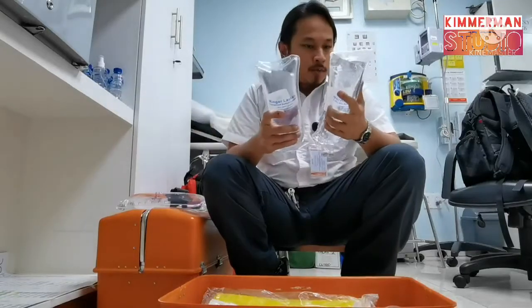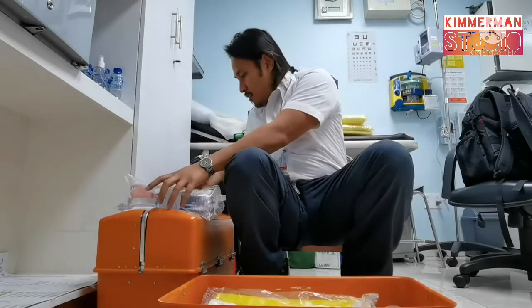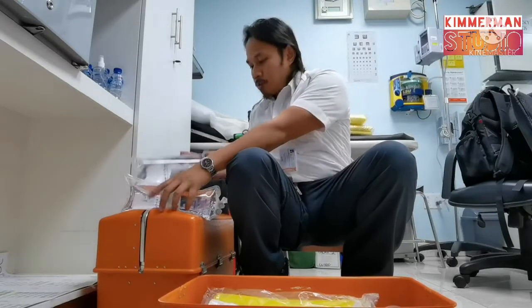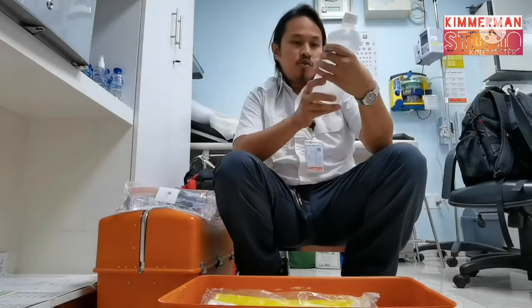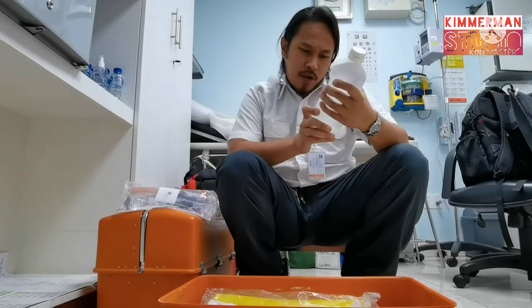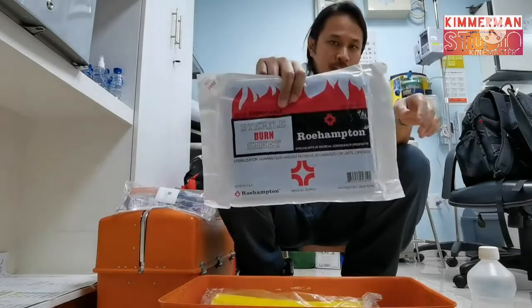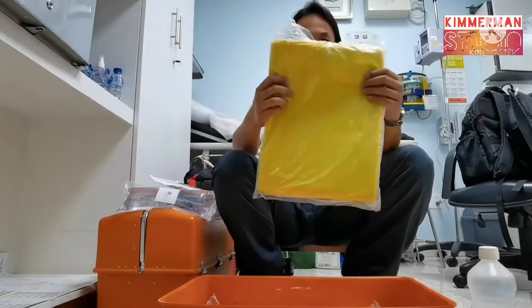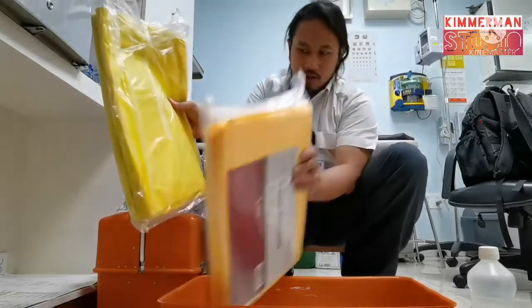Let's check the expiration dates. Okay. Not expired. Not expired. We have here sodium chloride for irrigation. So it's not expired also. We have here burn sheet. This is shrouds. And blanket.